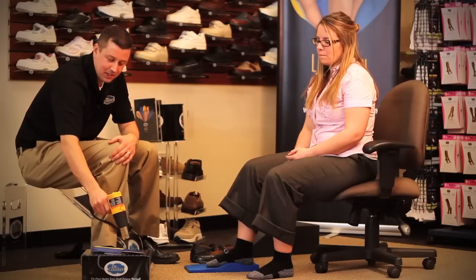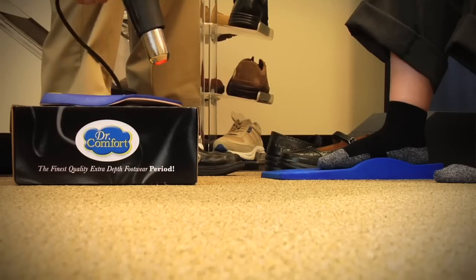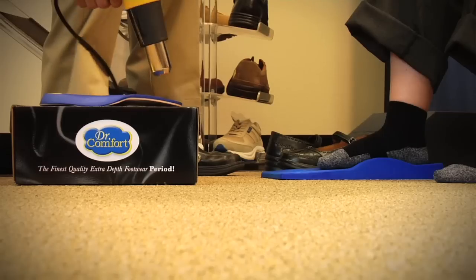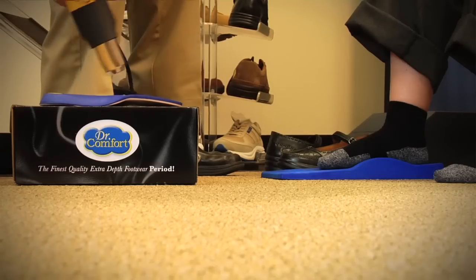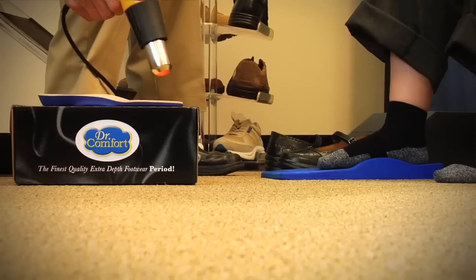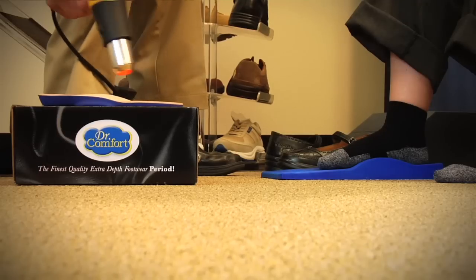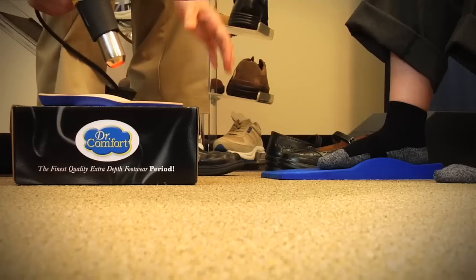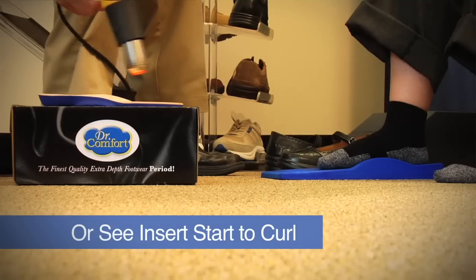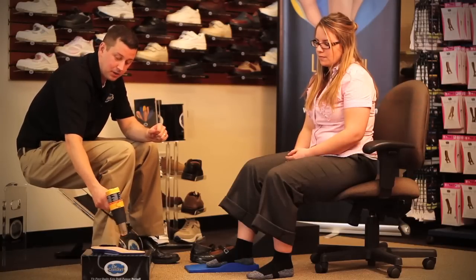Starting with the bottom of the insert, focusing on the forefoot and arch to achieve total arch contact. Keep the heat gun constantly moving and at a safe distance, because you don't want to focus too much heat on one particular area. This heat gun goes above 230 degrees Fahrenheit, so it really depends on the heat gun how long you'll need to heat mold the insert. Once you've heat molded the bottom, focus on the top — again focusing on the forefoot and arch. There are two ways to know when the insert has been heat molded enough: you can leave a thumb print on the insert itself, or you'll start to see the insert curl just a little bit. If you notice it's getting a golden brown, that's a bad sign — you've burned the insert; contact customer service and they'll get you a new one.